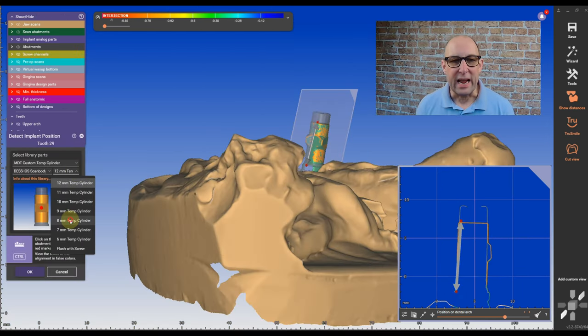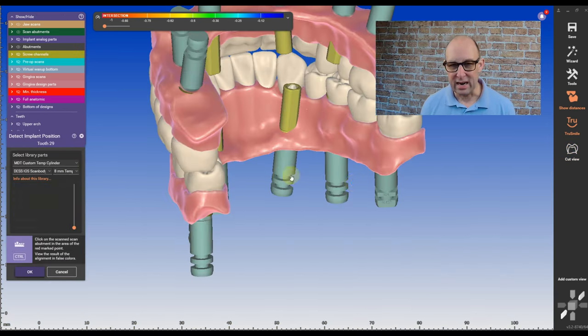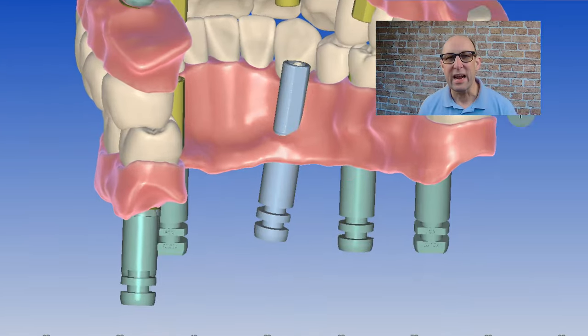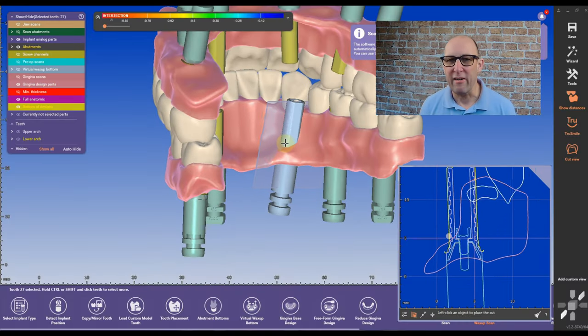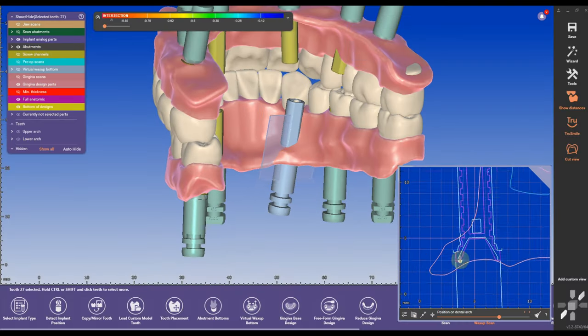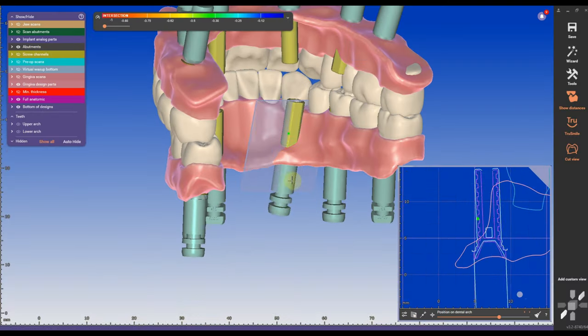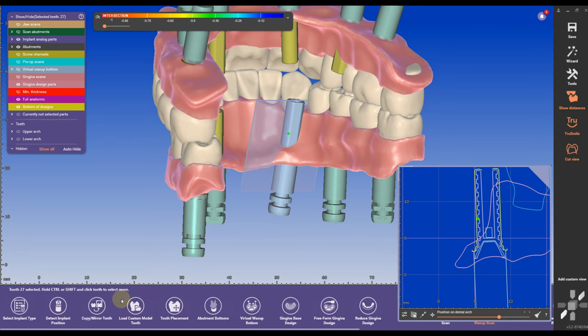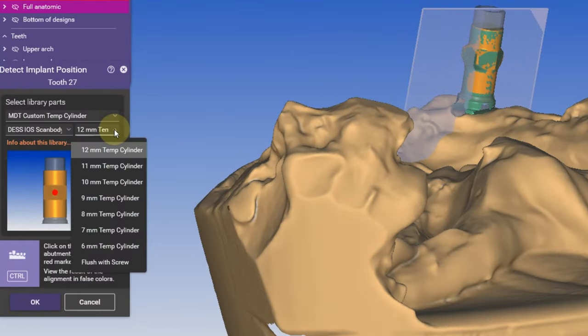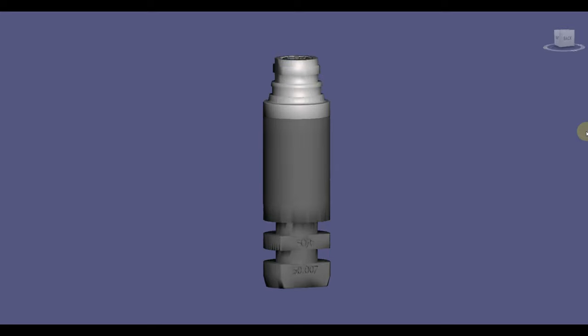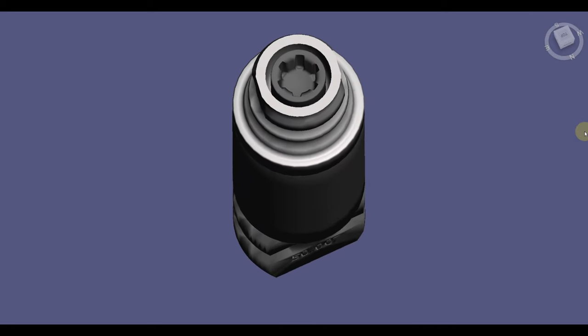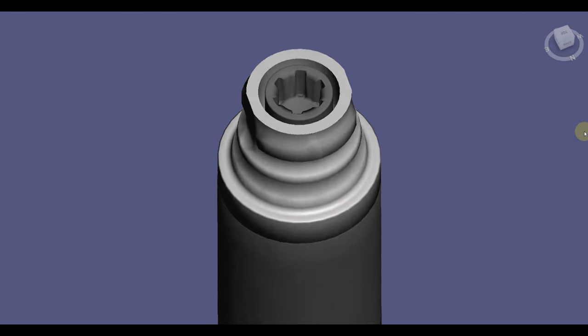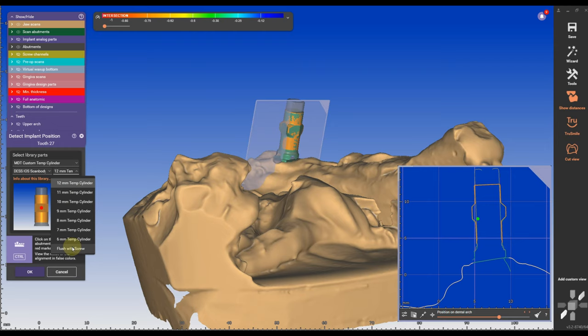I can do the same thing with other sides. I can change the temp cylinders from one side to the other, especially in an anterior region where we don't have much space. In this case, for example, the gingival height is very limited and I measure it. And I'm going to go to the flush screw. Flush screw is about 4.1 millimeter height and the screw is right at the tie base.